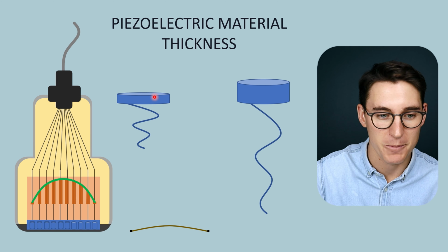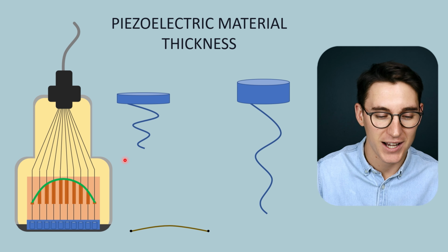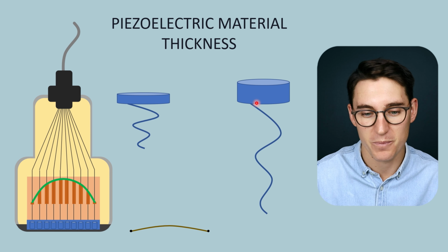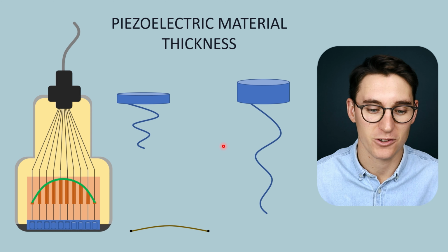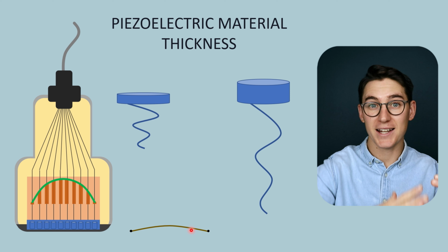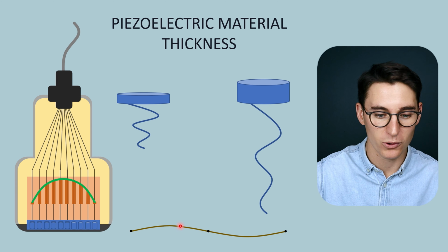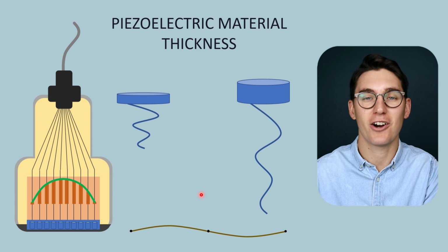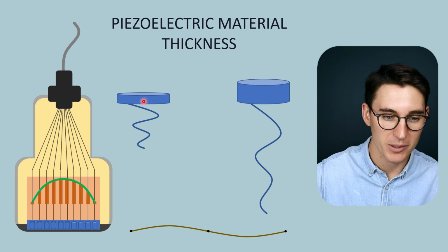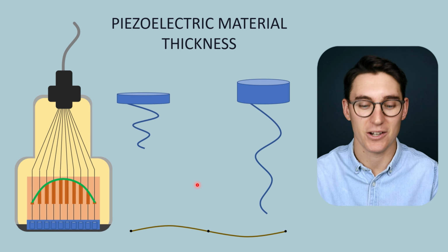The same thing happens here. As we shorten our piezoelectric material, the frequency that it produces is higher, the pitch is higher. The longer our guitar string or the thicker our piezoelectric material, the lower the frequency in our ultrasound wave. Now when you look at a guitar string like this, you can see that when you strum it, what you get is half a wavelength. If we were to add another guitar string on, we would get a full wavelength here. Now when we go about calculating the frequency that a piezoelectric material will generate, it's this concept of the piezoelectric thickness being half a wavelength that helps us to calculate that frequency.